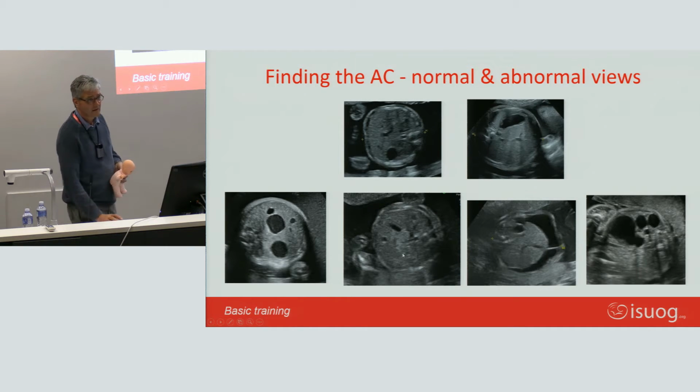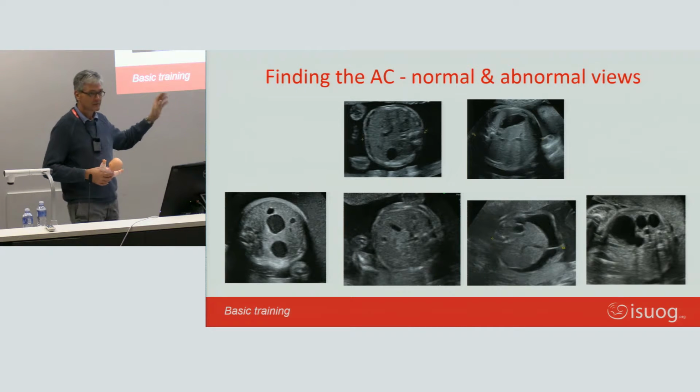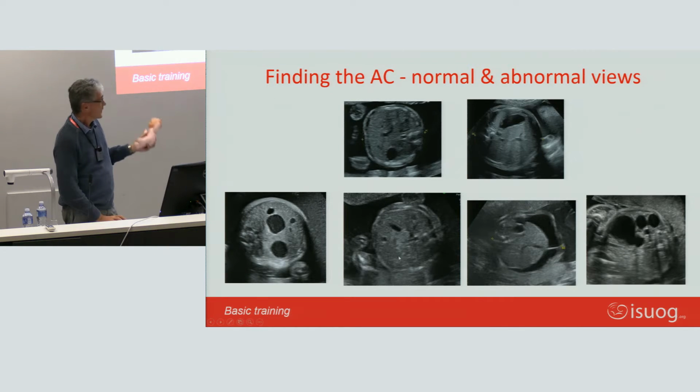And again, they talk about 4D scan, and what's the fourth dimension? Time. So you let time go by. You give her a cup of tea, read the Sarie and catch up on the news in the Huisgenoot, and I see you back in an hour. And maybe the stomach is filled up again. And if it hasn't, then she can take her Sarie and her Huisgenoot and get onto the bus to sort out what's happening. Right, and here we see stomach, lots of other stuff.